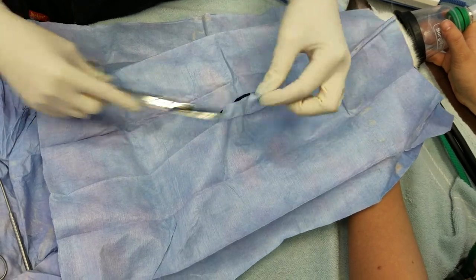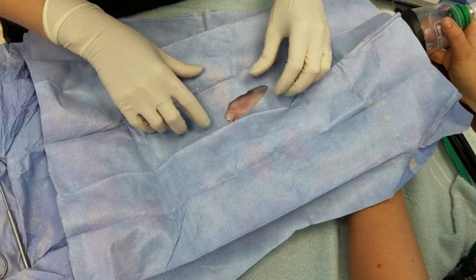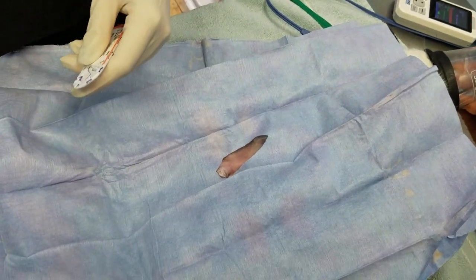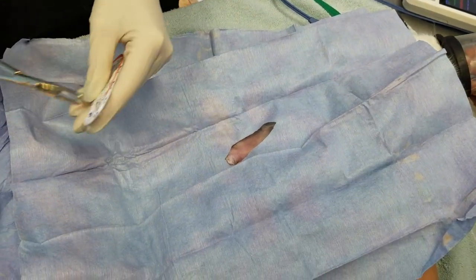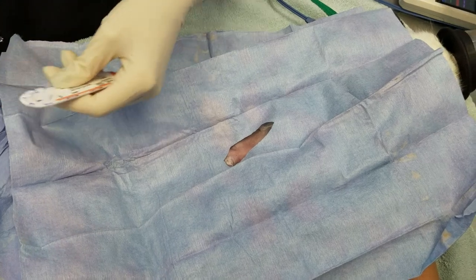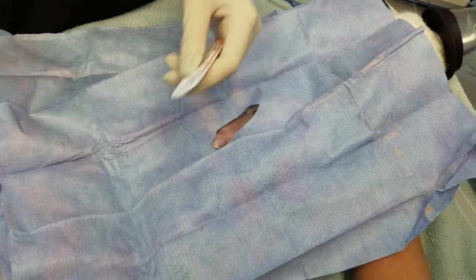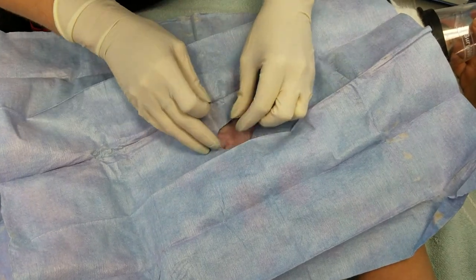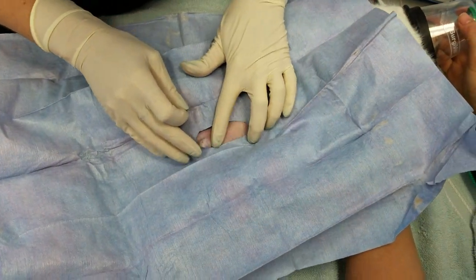Routine prep, you just want to be super careful of their very thin skin. When I was taught to do rabbits, they described it as pretend you're making your incision and that will be deep enough.